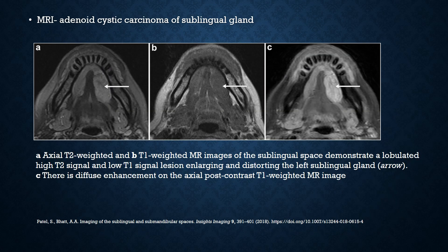This is an example of an adenoid cystic carcinoma of the sublingual salivary gland, indicated by the white arrow. The image in the sublingual space demonstrates a lobulated mass with high T2 signal and low T1 signal, enlarging and distorting the entire left sublingual gland. There is also diffuse enhancement seen on the post-contrast image.